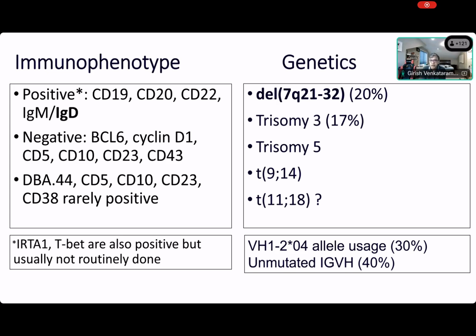Okay, let me throw a trivia question. What cells in a normal marrow will express cyclin D1? What would be the internal control? Anybody? You have to know your internal control for every stain in heme, right? Like the back of your palm, you need to know it because many stains won't work, and when it doesn't work, you have to know when it doesn't work. Just seeing an external positive control is not sufficient. Anybody want to venture what cells will express cyclin D1 in a normal marrow? Endothelial cells, and that is correct. Okay, one more. Anybody?